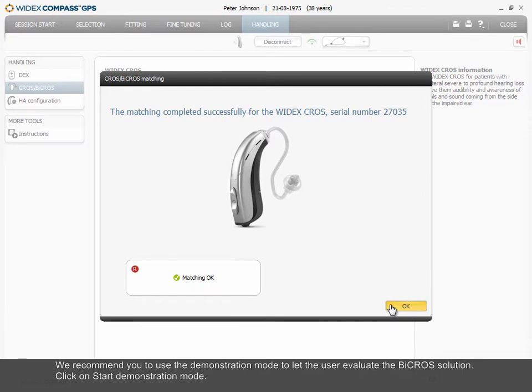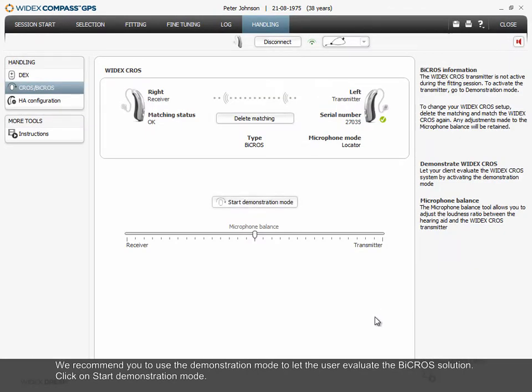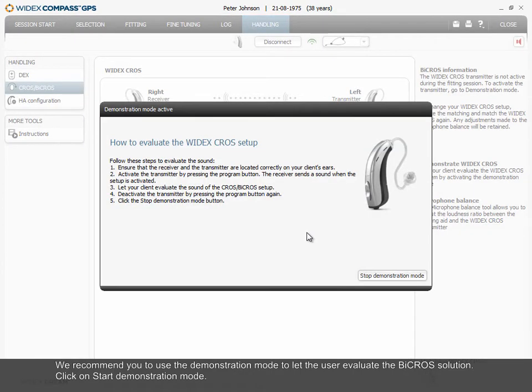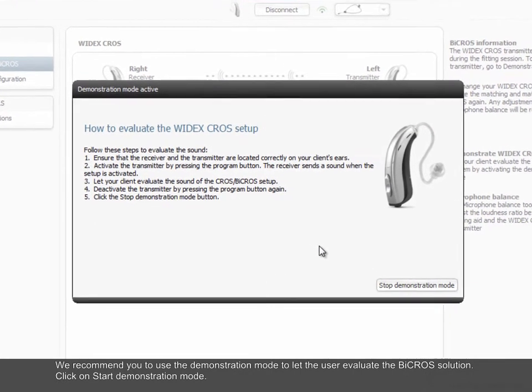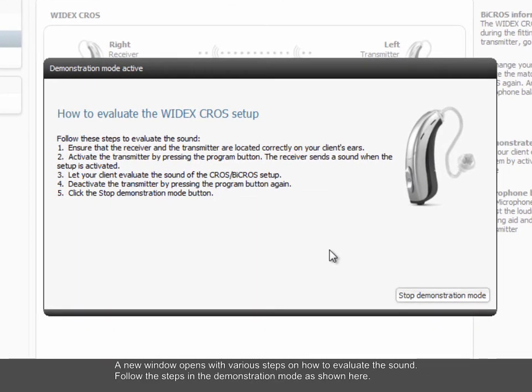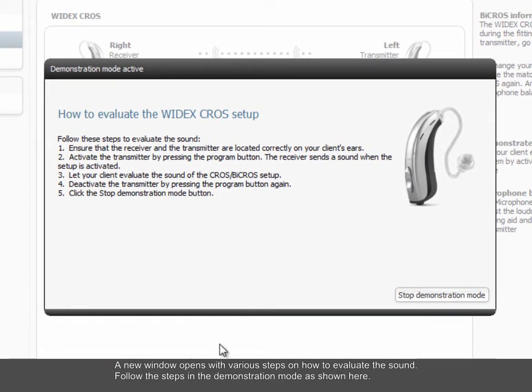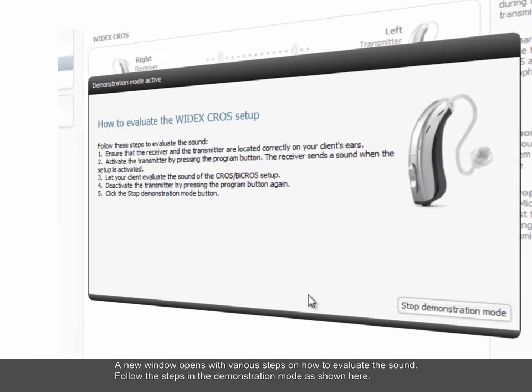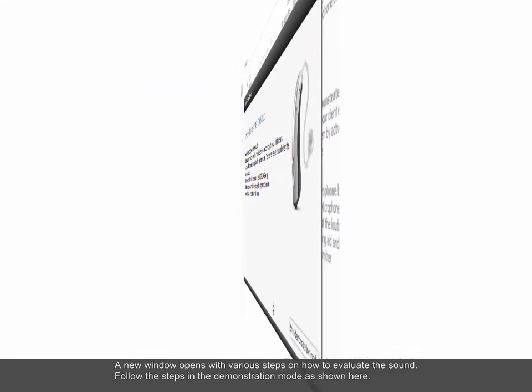We recommend you to use the demonstration mode to let the user evaluate the bi-CROS solution. Click on Start Demonstration Mode. A new window opens with various steps on how to evaluate the sound. Follow the steps in the demonstration mode as shown here.